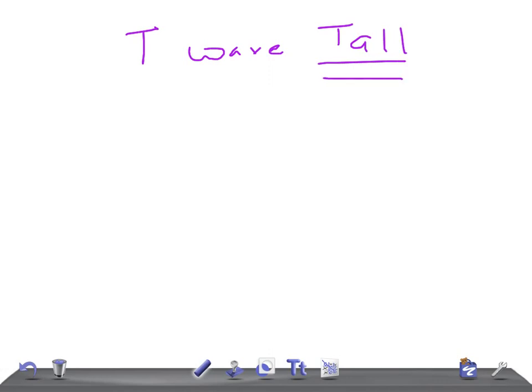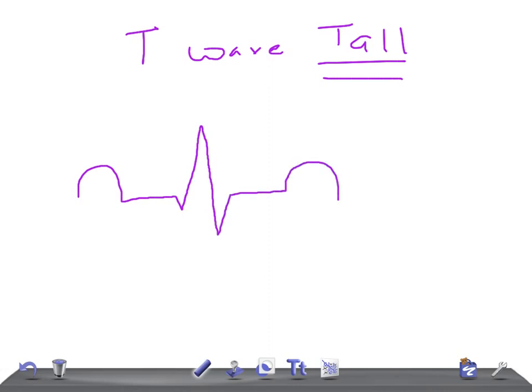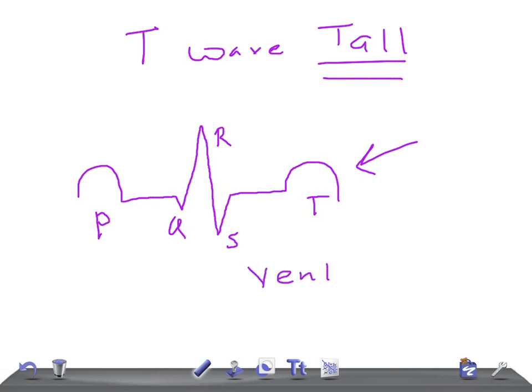To understand this, we should know the normal variation of T waves. First, why is there a T wave in an EKG? We have P, Q, R, S, and T. The T wave corresponds to ventricular repolarization.